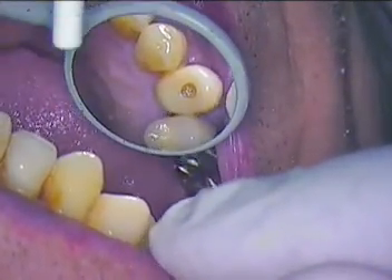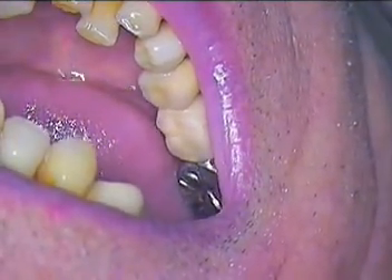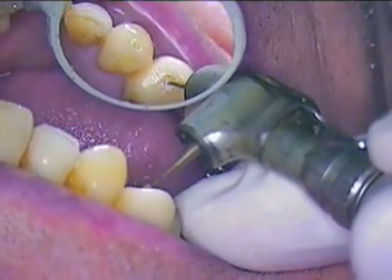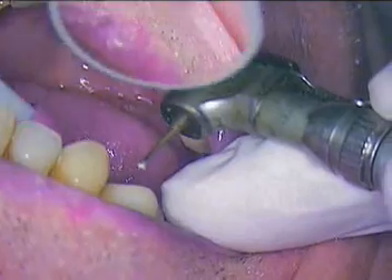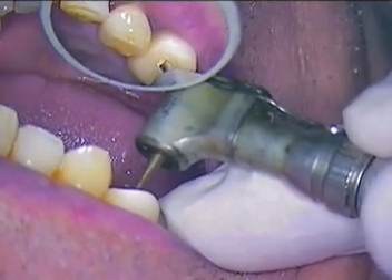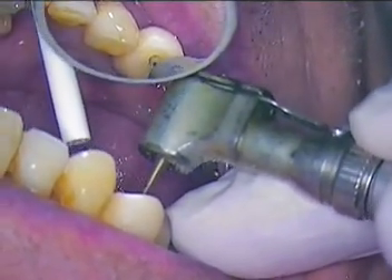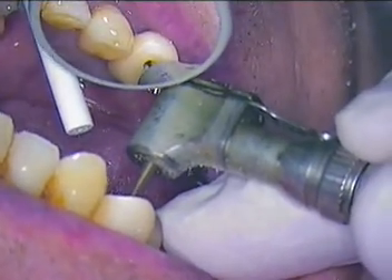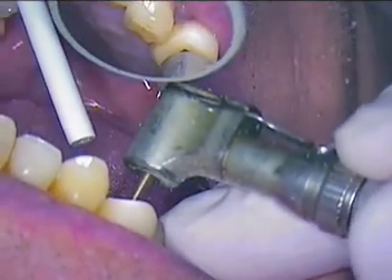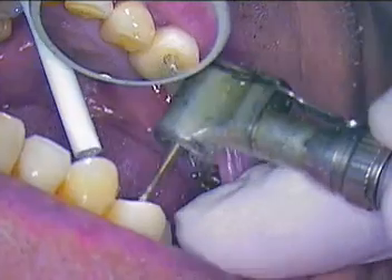Tooth number five and we're going to go ahead and remove the temporary — it's a screw-retained temporary. We should just clean off some of the cement first, and there should be a small piece of cotton within the temporary. Today we're going to be using a modified bone level transfer coping that was designed for this particular case, already made and ready to go. We are working without anesthetic; there's no need for anesthetic even with the bone level, and we'll explain what that's all about during the procedure.